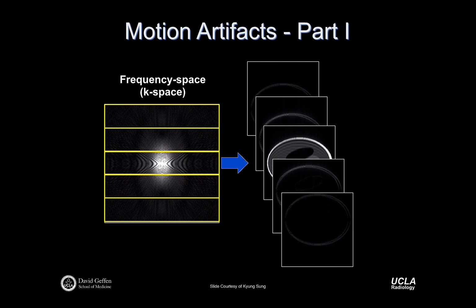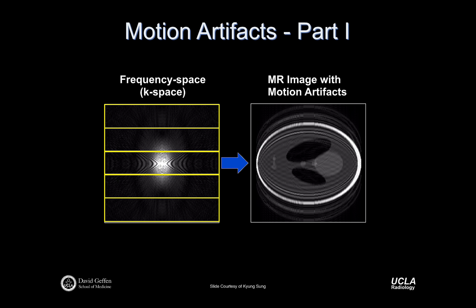So that when we take the 2D Fourier transform of all of those funny-looking images, all of these blocks of k-space to get those sub-images, and combine them, then you're going to get this artifact image in the end. And so stepping through that, you can actually see that, in fact, there was some Gibbs ringing for that middle part of k-space, and then there's all this other sort of motion artifact nonsense that's outside of the direction. So there's a few things that we can learn from this. One, we get this appreciation of sort of why motion during phase encoding is problematic.